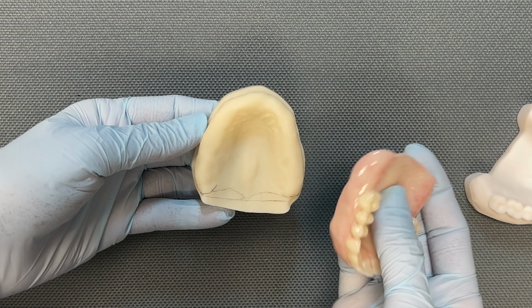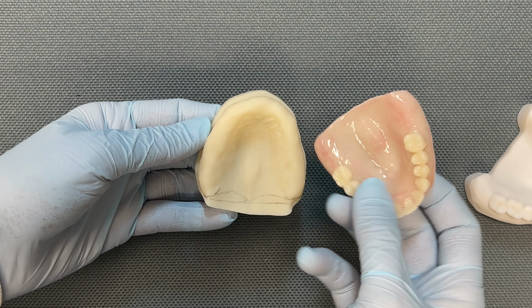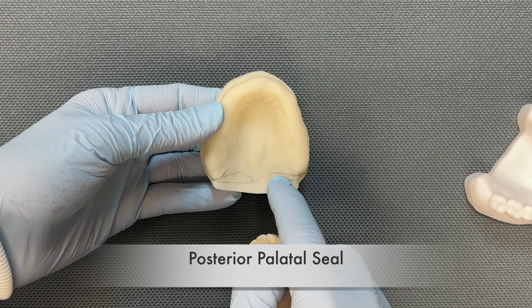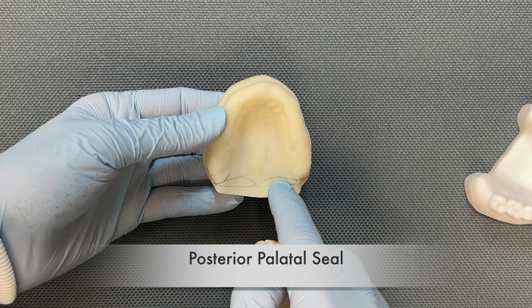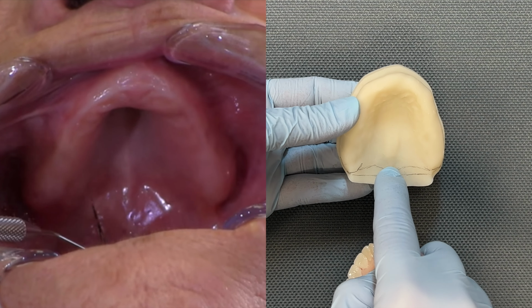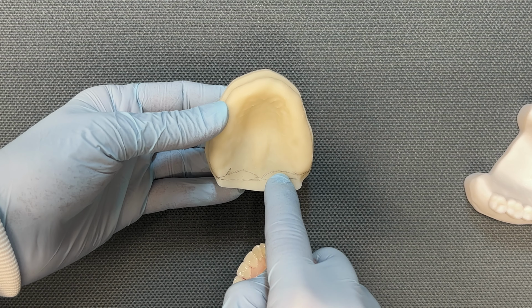So just some of the things I want to show you about a denture. One, we've got all of this material here, the palate. So that's going to sit on the roof of the mouth, and it's going to extend way back here. So this is going to be what we call the posterior palatal seal, and it kind of looks like a little Cupid's bow there. So if you took your finger and ran it across the roof of your mouth, all of this is going to be hard. This is the hard palate, and then you're going to get back here, and you're going to be able to push it in a little bit. It's going to get soft. This is the soft palate.